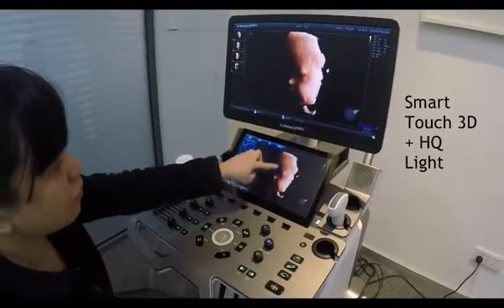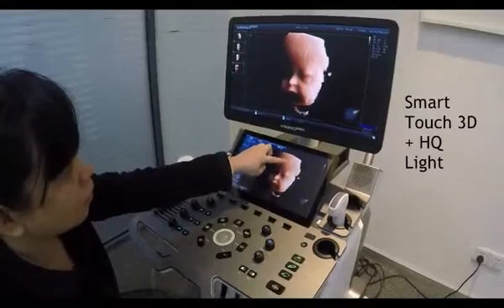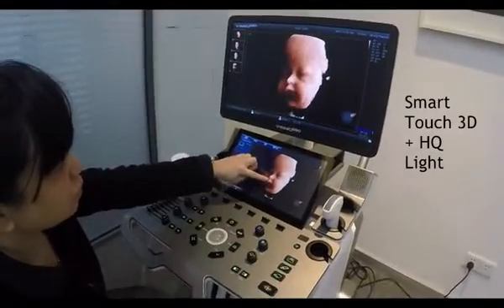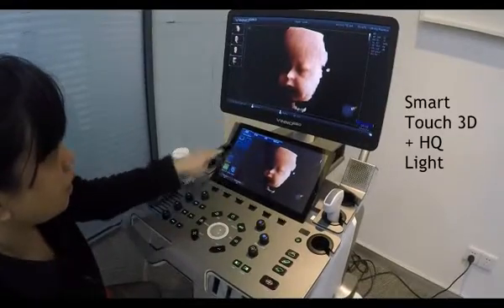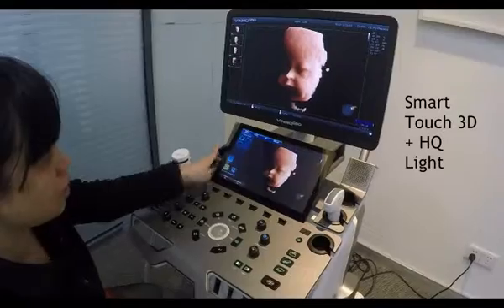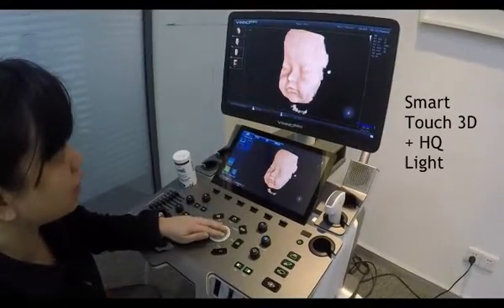I can view the baby face from the side and then from the top. And by pressing the HQ light button on the touch screen, I can adjust the direction of the light source again.